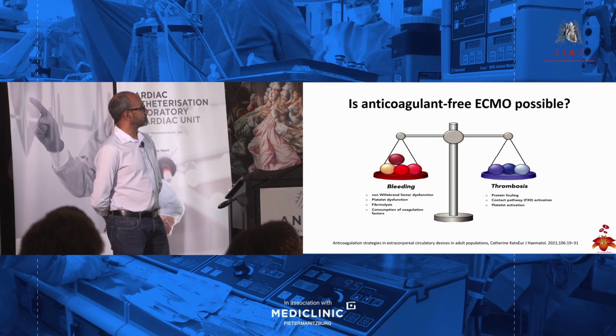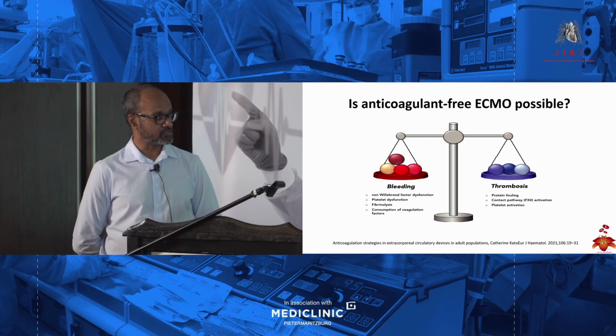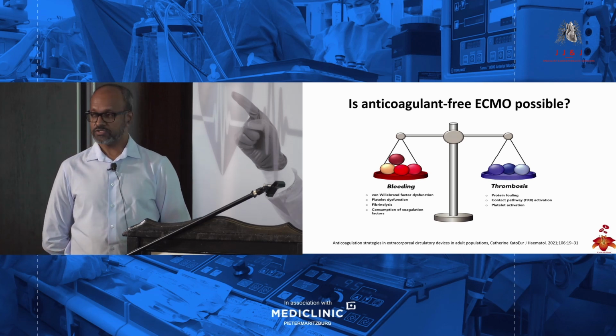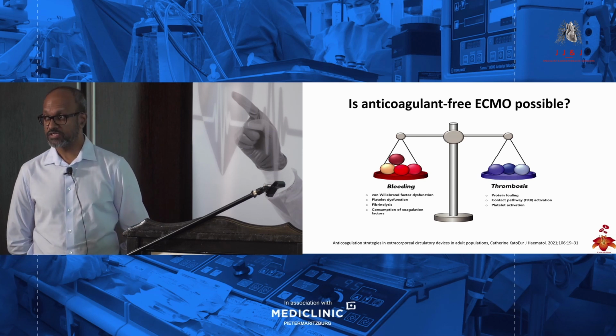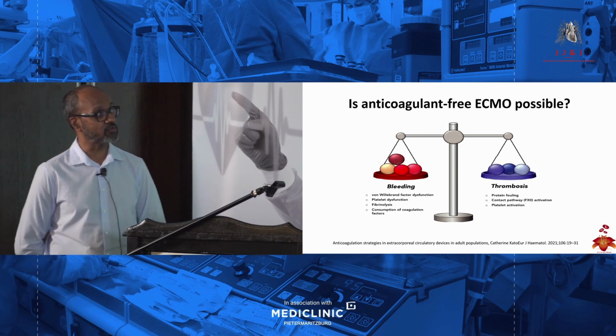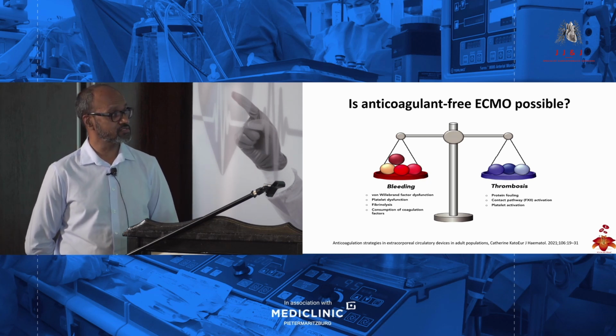So, is anticoagulant-free ECMO possible? Well, we know we have this balance where we have lots of bleeding and lots of thrombosis. It depends on the clinical scenario that the patient is presenting, and we can then determine if we can use an anticoagulant-free ECMO circuit. Next slide.